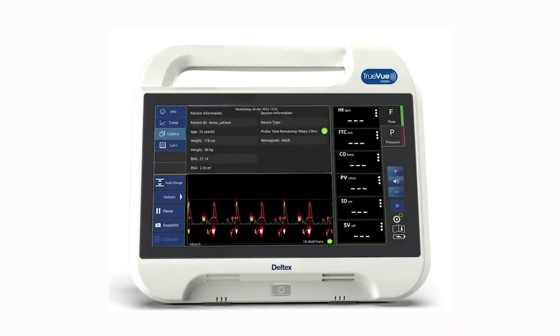Notice the intracardiac signal. Flow appears above and below the baseline, sounding fast, like a galloping horse. If this occurs, refocus and adjust the probe depth.